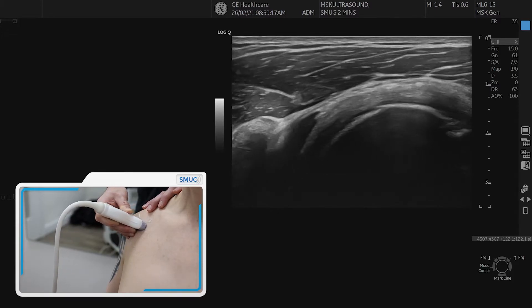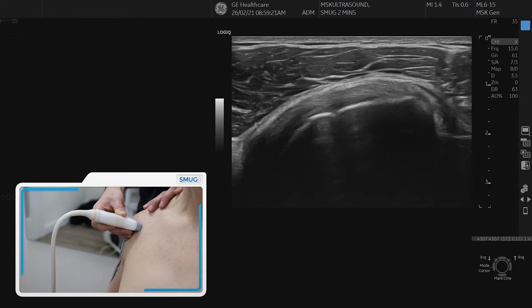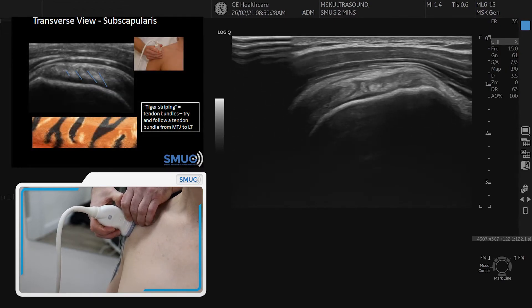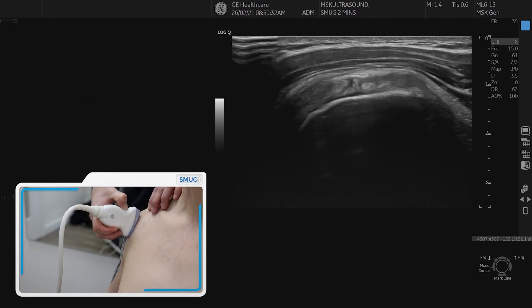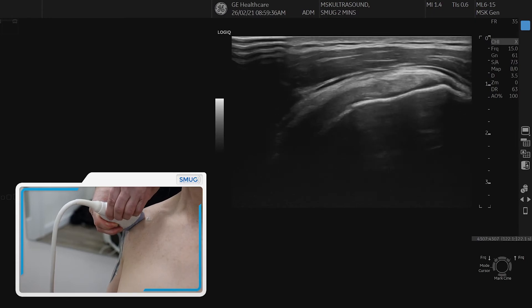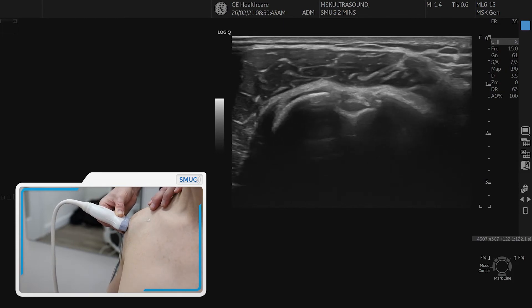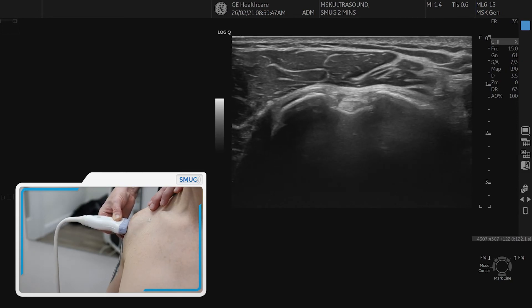Then we move back laterally and this is a good place to spin to see the subscapularis in transverse. We slowly do that and then you get what's called the tiger striping appearance of the subscapularis in transverse. Then we come back into the longitudinal — that's the subscapularis — and we go back to where we started, which is the cross section of the biceps in the bicipital groove, and that's where we stop.